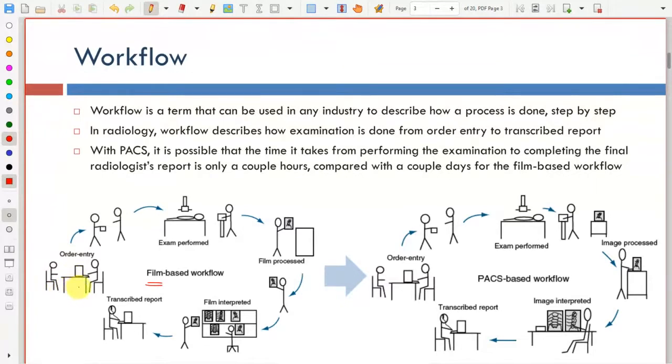Okay. Then after that, they would take the order, or the receipt from here, to the radiologist, who takes the patient to the radiology room and makes the examination.